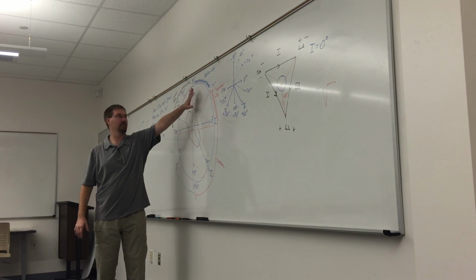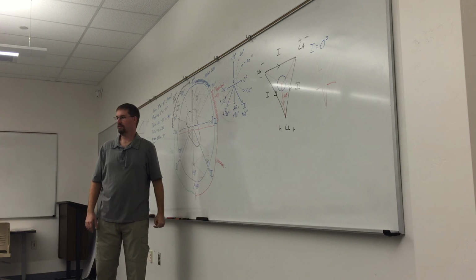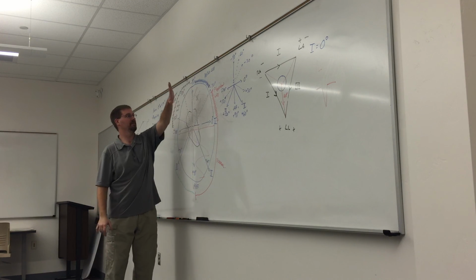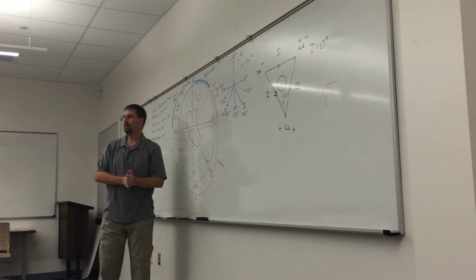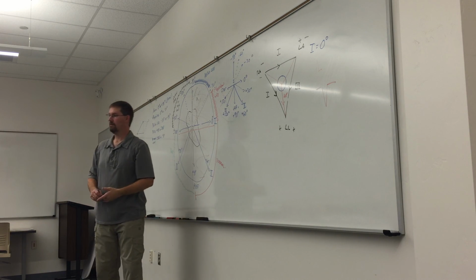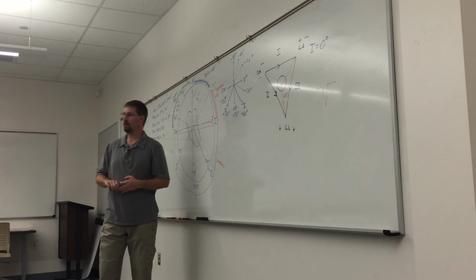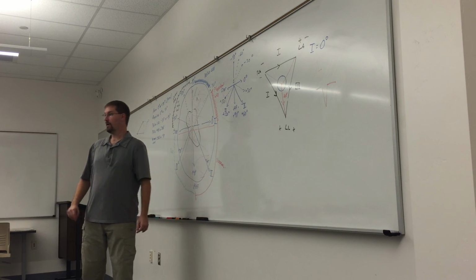Yeah, and all the colors fell. There's only one area. You guys remember doing Venn diagrams? You draw circles, you do little Venn diagrams, and what circle has all 3 colors in it? That's all we're doing here. All 3 colors meet at pathological. Yes, sir. So when you're looking at the QRS, you're taking the general direction. If more of it is negative than positive, then you say that it's negative. Is there going to be a time when it might be right on the line? Then in that point, you just go negative, generally, is what I do, because that makes it worse. It's kind of like, well, that's the worst case scenario. Are you guys cool with that?